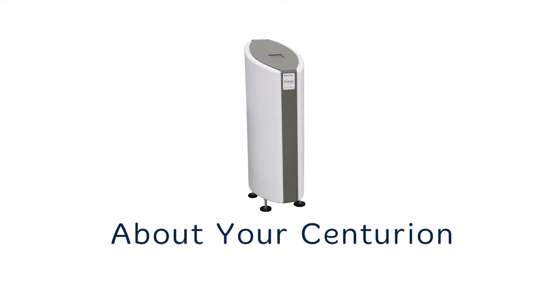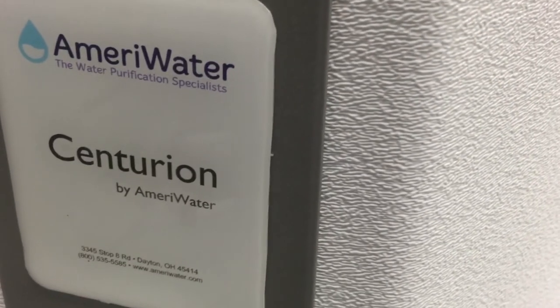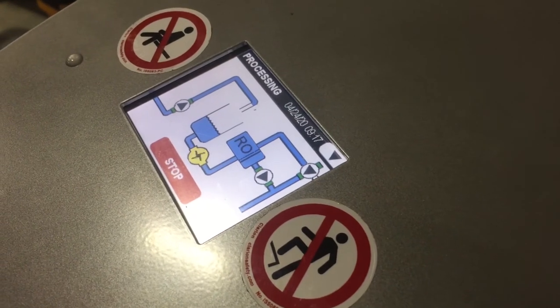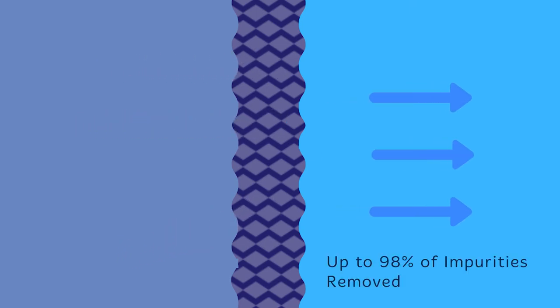The Centurion Bio AmeriWater is a single patient reverse osmosis unit which supplies up to 0.4 GPM of purified water based on a feed water supply at 50 degrees Fahrenheit for hemodialysis or renal replacement therapies. The unit is fitted with an internal pump that pressurizes the water supply and forces it through a membrane, separating impurities. Purified water passing through the membrane, also known as permeate, goes to the dialysis machine and the rejected impurities are flushed to the drain.